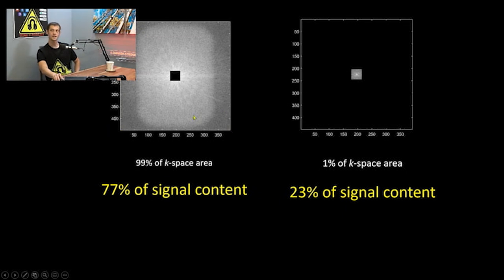Because frequency encode is very fast, you get this entire line, quote, for free, versus doing these phase encodes going left to right, which takes time to get to a different TR. So if you don't have parallel imaging, it's only grabbing one line per echo. With an old-fashioned spin echo, you're grabbing one phase encode per spin echo. If you're doing fast spin echo or turbo spin echo, it's whatever your echo train is, so with an echo train of 8, you're getting 8 lines. So it pretty much directly affects your scan time, right?